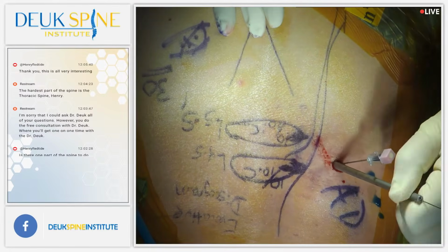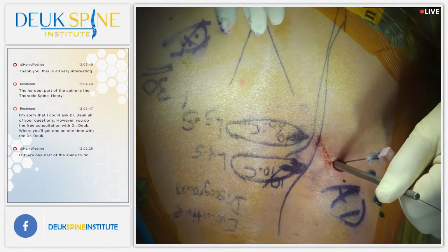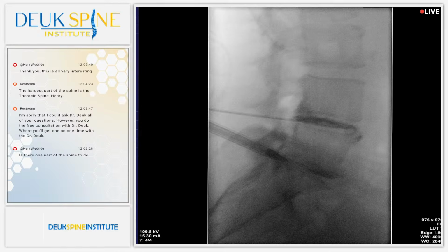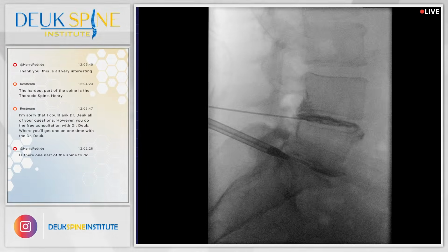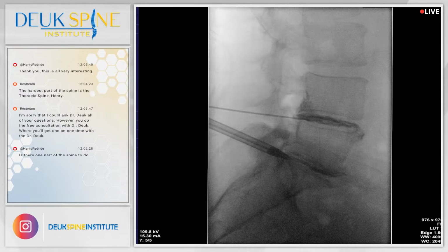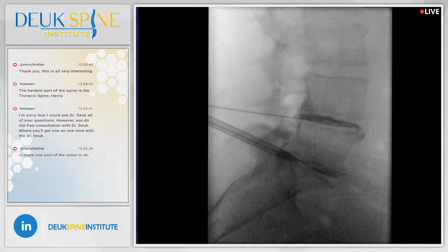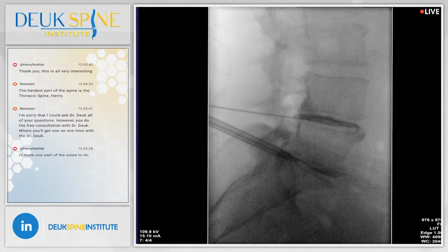We're going to start at L5-S1. Shot? Thank you, Jordan. We are now at the L5-S1 disc. Now we're going to enter the disc through the herniation and tear in the back of the disc. That way we don't do any additional damage to her disc. We're going to go right in through the tear.